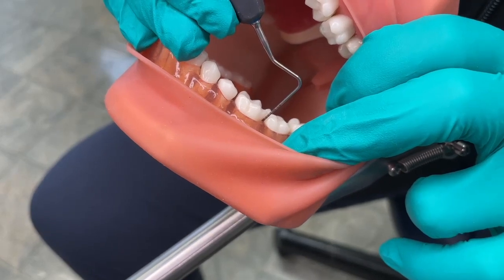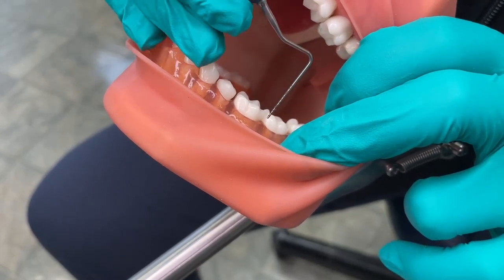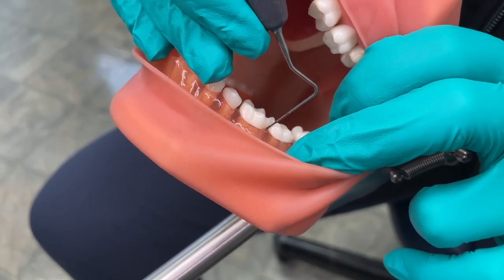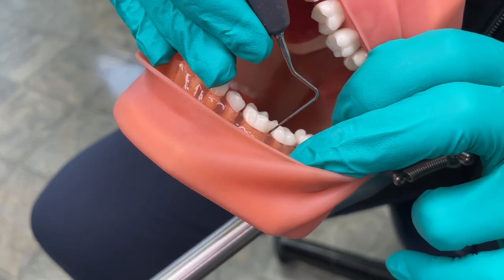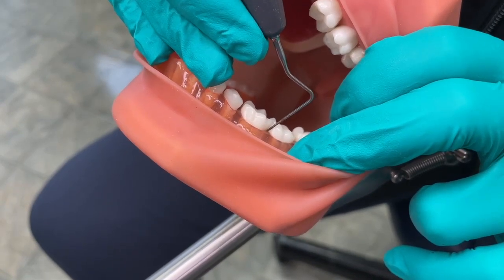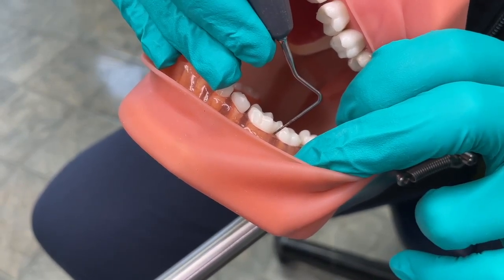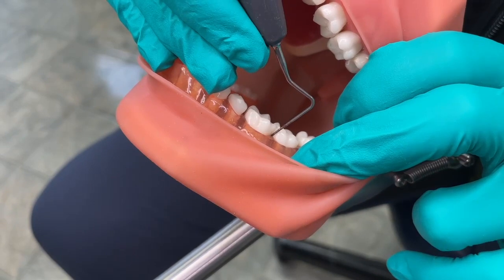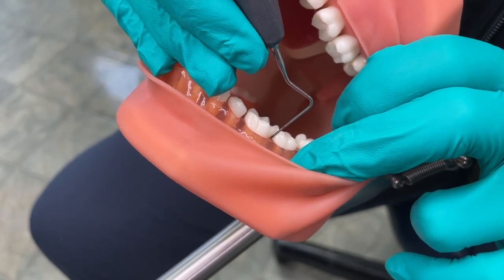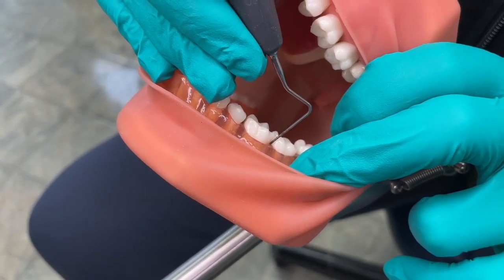Then what you need to do is bring your probe up just a little bit and find where the CEJ is interproximally. You might feel a little jump or a little difference, or if you go a little bit more subgingival, you might be able to feel the cementum versus the enamel. That's how you know where that junction is.